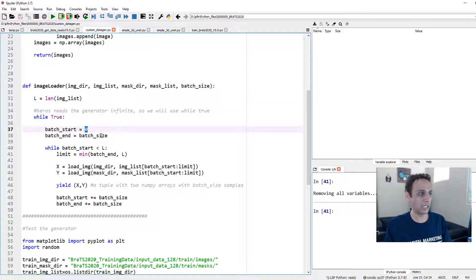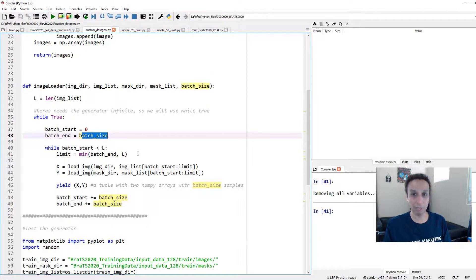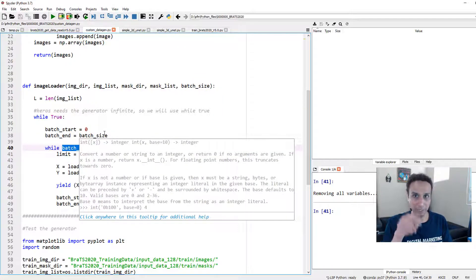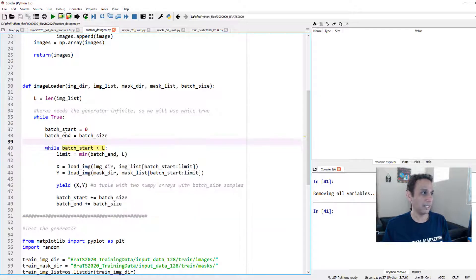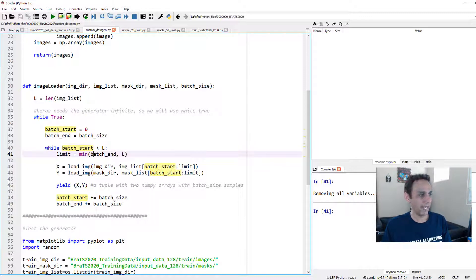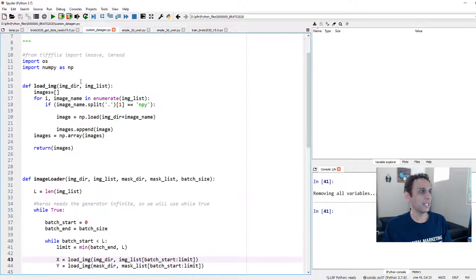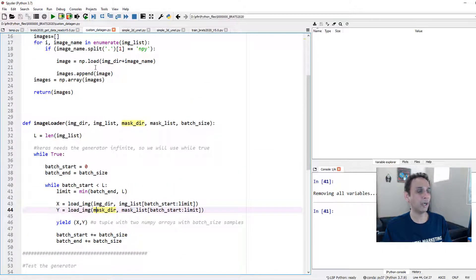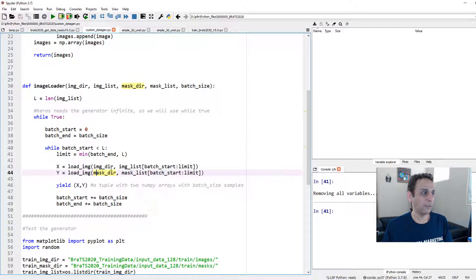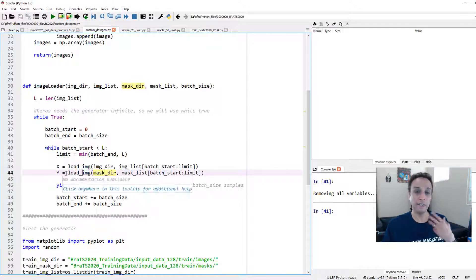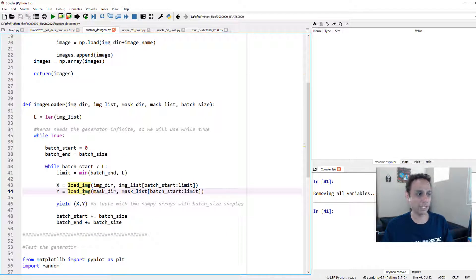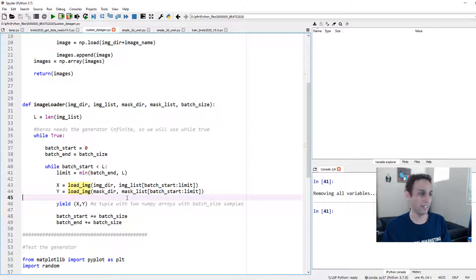So while true, do the following. My starting batch is zero and my ending batch is whatever the batch size is. So if my batch size is 16, so go from zero to 16 and do something. So while batch_start is less than my total number of images, then do this. This is my limit and x is loading an image, y is loading my mask.